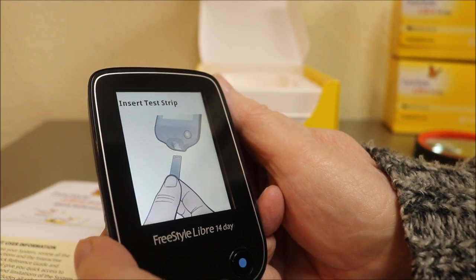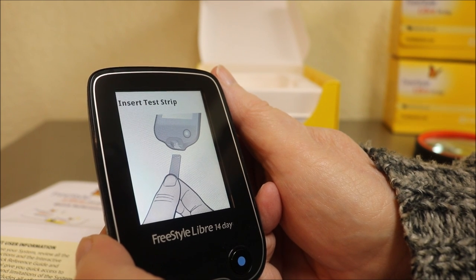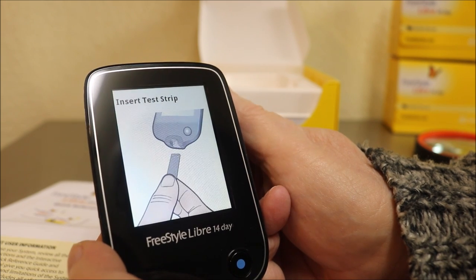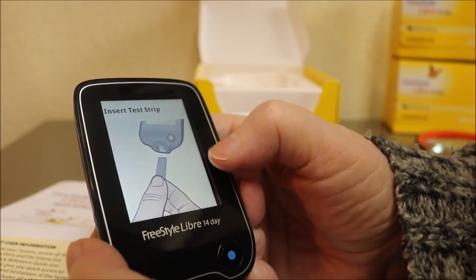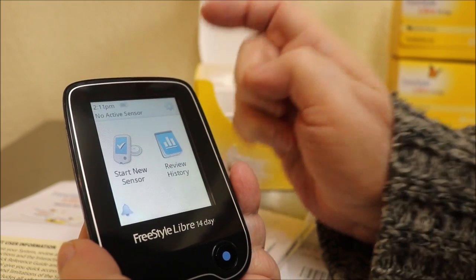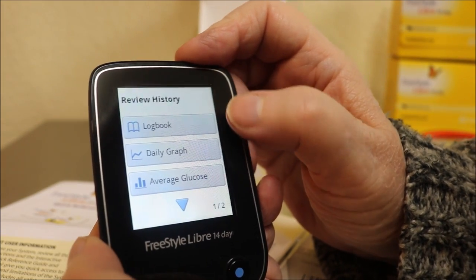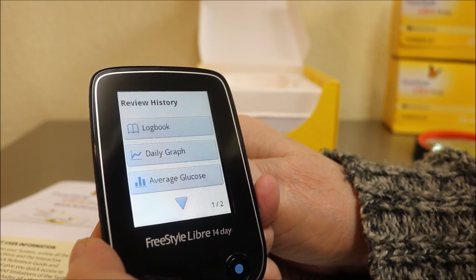A lot of meters require you to put control liquid on a test strip to calibrate it, but this one you can just stick a test strip in and do a reading. The logbook button reviews your data — it gives you a daily graph showing your fluctuations and times, and your average glucose for the day, which is helpful for your hemoglobin A1C.